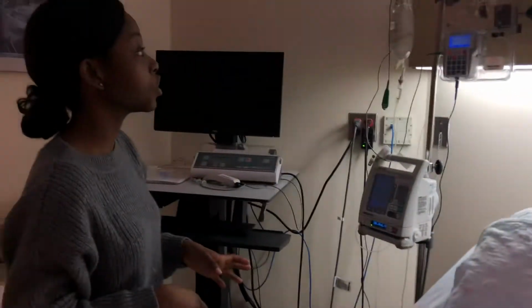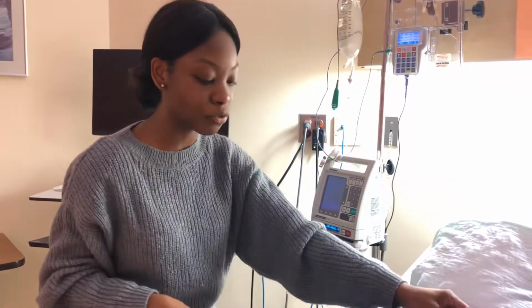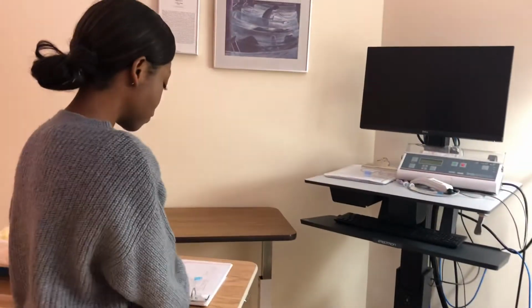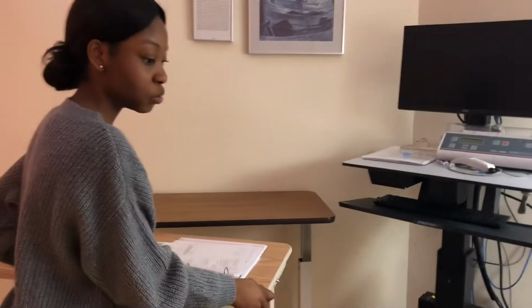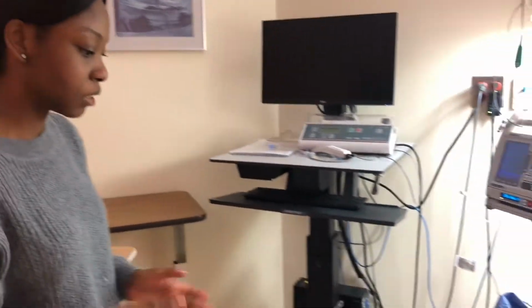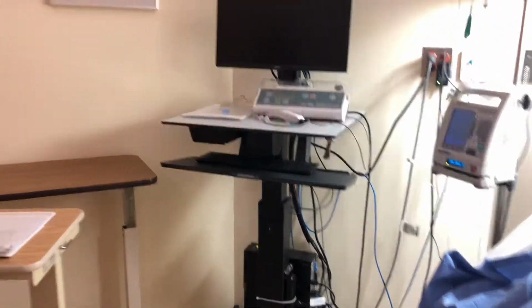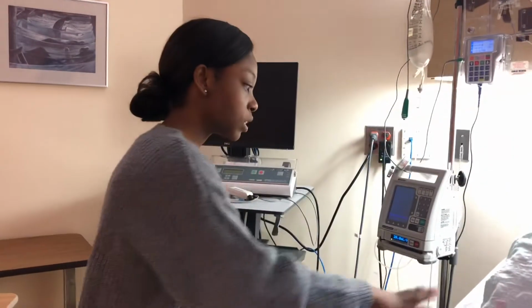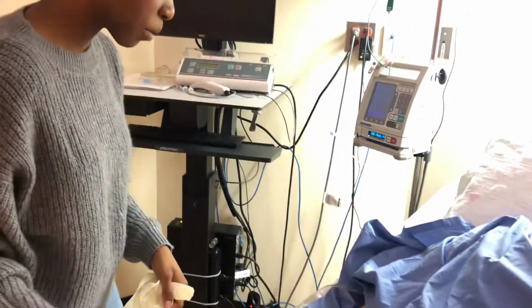So I'll do my exit safety check, and I'll go ahead and document this medication. And for morphine, I'm going to have my Narcan ready just in case they go into adverse reaction. So next, I am going to do my chest tube dressing. So the patient is still comfortable in a safe position. So I'm putting them in a semi-fowler. They're already in a semi-fowler position.